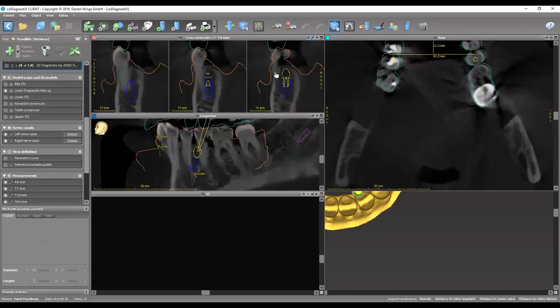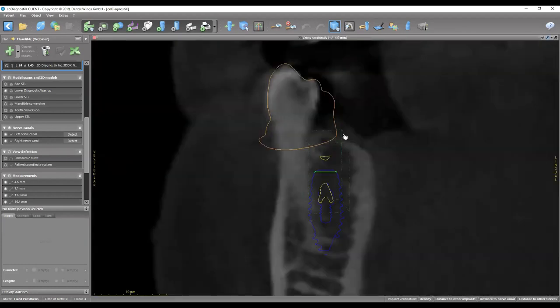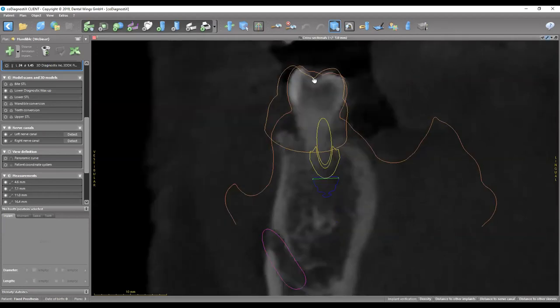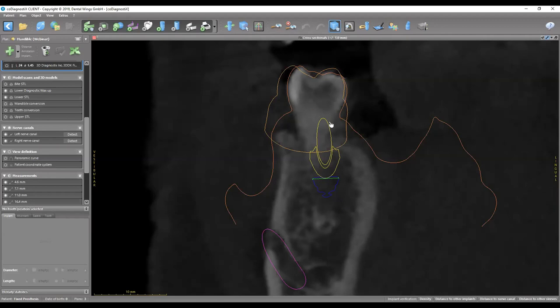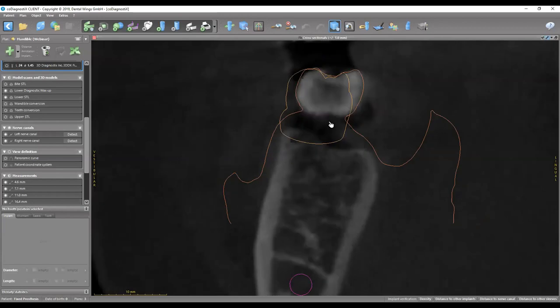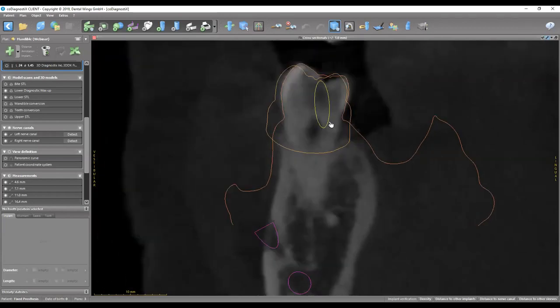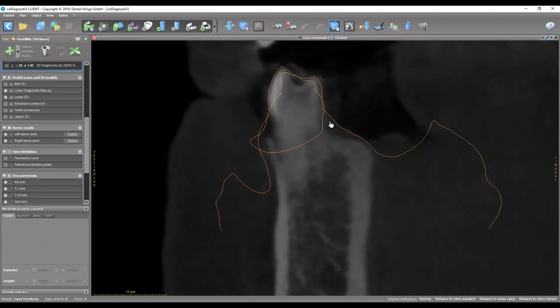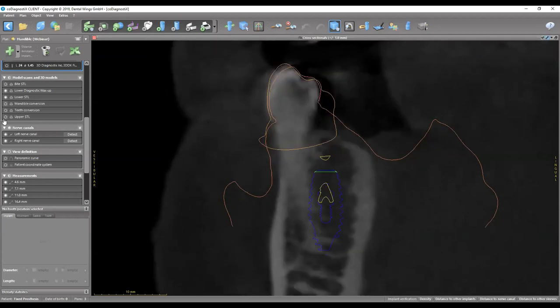Since this is going to be a provisional PMMA prosthesis, we removed the second bicuspid from the occlusion. The reason is for provisionals, we want less forces on these implants while they're still integrating, so we decrease the span of the restorations up to the first molar and remove the second bicuspid. Looking at the cross section, the yellow represents the wax-up and the orange is the actual patient dentition. There's a slight difference, but the patient had class one occlusion without too much abnormality, so we enhanced the wax-up to reflect the final prosthesis.